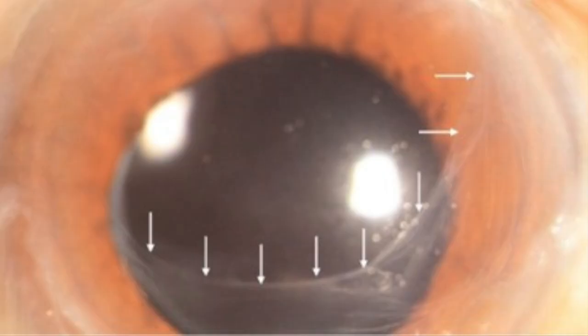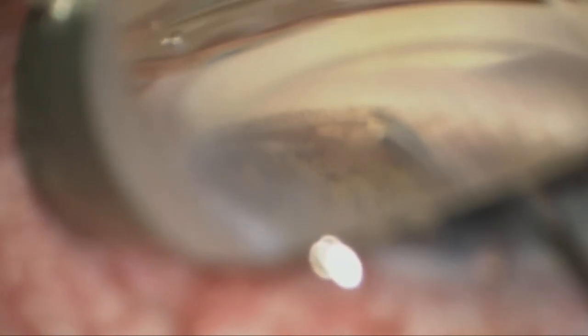While performing the canaloplasty, it is important to keep the AC well maintained to ensure a favorable pressure gradient to minimize the risk of a Descemet detachment. If the blinking red light disappears from view, the catheter may have tracked posteriorly into the suprachoroidal space, so the actuator should be pulled back to retract the catheter, and another attempt can be made. It is important not to inject viscoelastic when the blinking red light cannot be visualized.